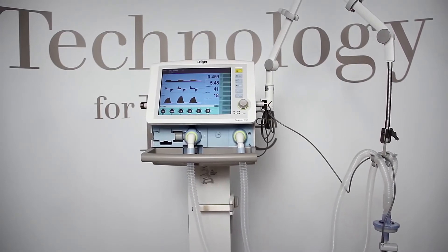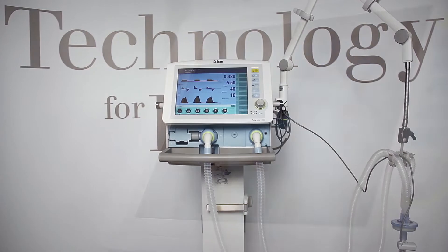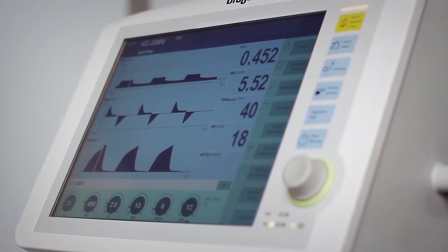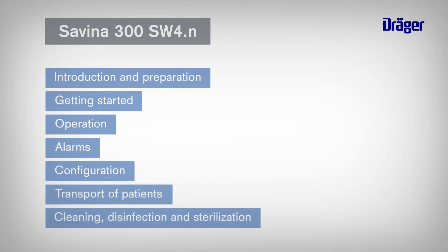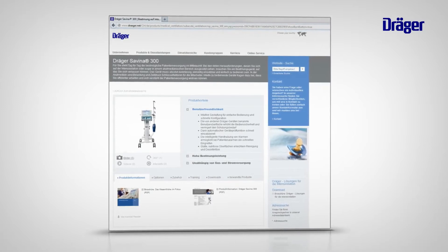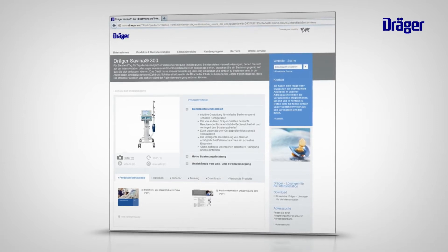This video explains the most important functions of Savina 300. It also explains how to prepare and to start operation of the device, and moreover how to use and clean it. This video is divided into different sections which allow you to easily navigate. Further information on Savina 300 can be found in the interactive Savina 300 product trainer and on the Draeger website. You will see that Savina 300 is a ventilator that is simple and intuitive to use.